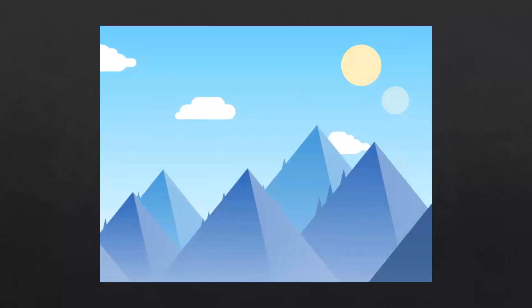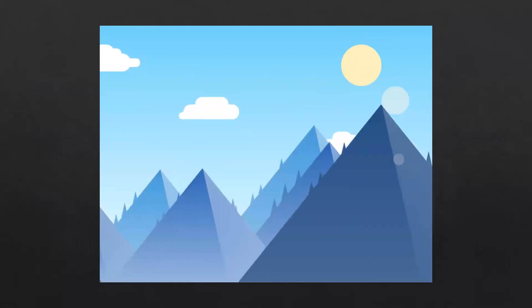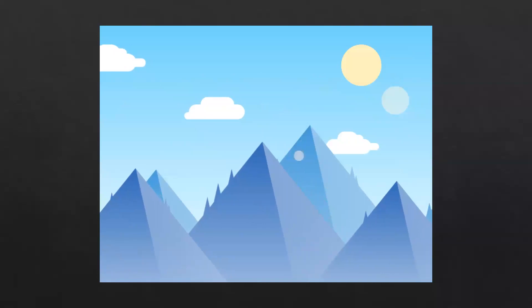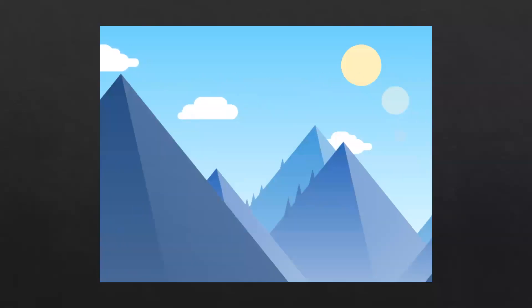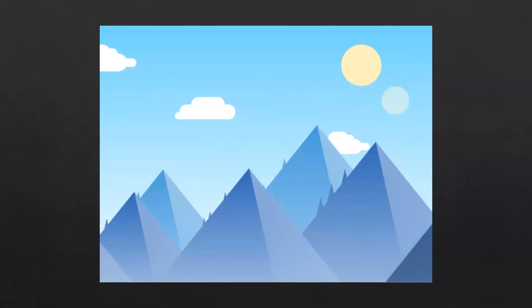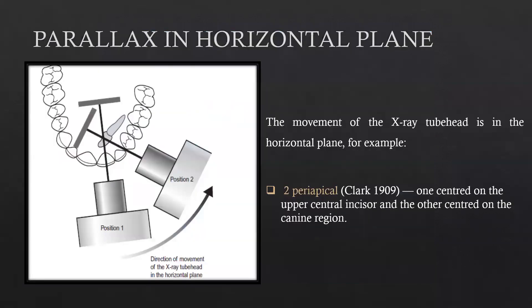This also shows the same thing: when moving to the left side, the nearer object moves in the opposite direction and the farther object moves in the same direction. Parallax can happen in the horizontal plane as well as the vertical plane. To obtain parallax in the horizontal plane we move the x-ray tube head by changing the horizontal angulation — for example, taking one IOPA radiograph centered on the central incisor and another centered on the canine region.